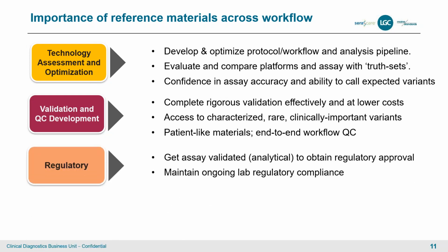Once you've done that, you have your regulatory compliance, right? So think about this, it is now growing worldwide. It's no longer adequate for you to just have a lab developed test. A lot of regulatory bodies are now being very stringent. It's very important for you to get the assay validated, right? So you're submitting to your local authority to get approval. Not only that, you have to maintain ongoing compliance.